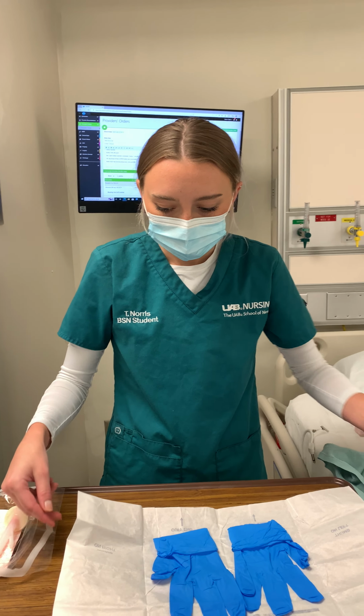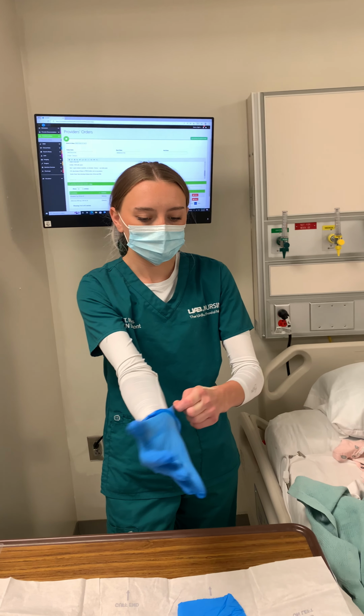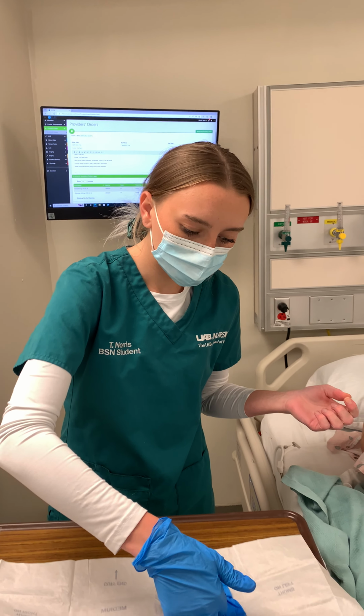And typically you would have a pair of sterile gloves in this pack. I unfortunately broke mine, but for the purpose of this validation, I'll be using regular clean gloves in the place of them. So I'm going to start with my dominant hand. Right, and then my non-dominant.